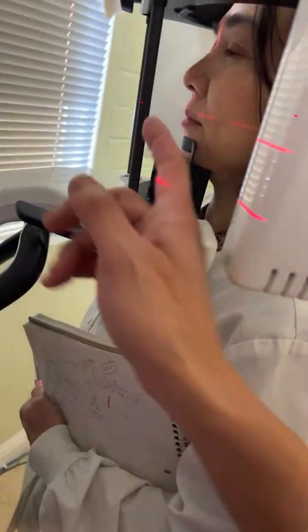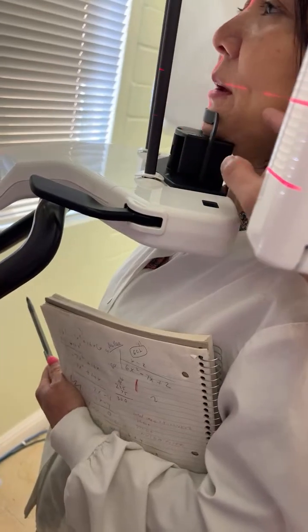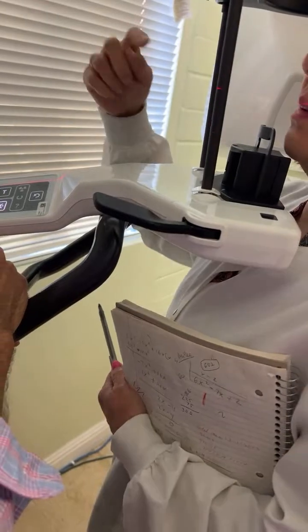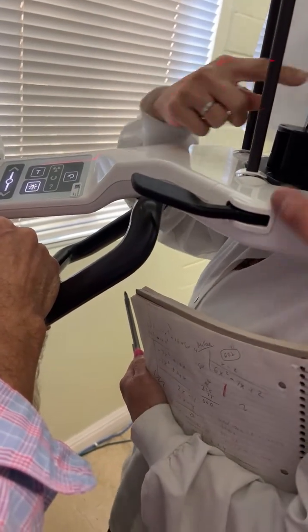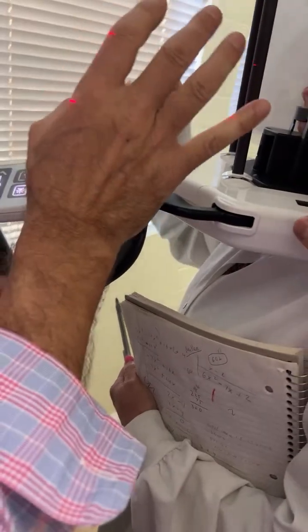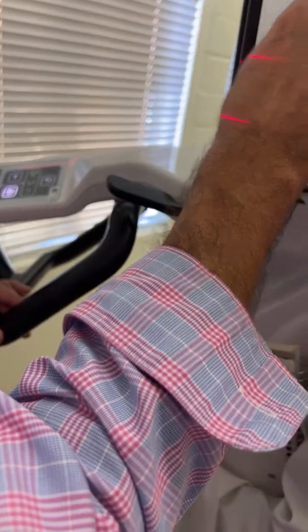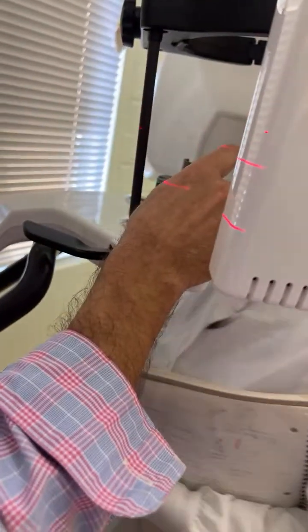See, that's upper and that's the lower. This is a 5x5. Or is it this, could be 6x9. So the light of this is one. Remember the field we select from the app? This light can move up here, depending on what you select. So right now, this indicator is just the bottom. But keep in mind, when you do the scout shot, you have the ability to move this laser line up higher and higher, depending on what you select. So what you see is the border of the X-ray, the upper height, the upper limit. Got it.